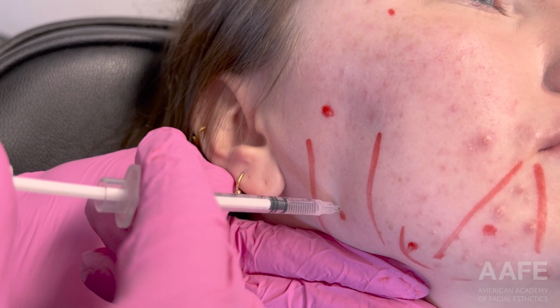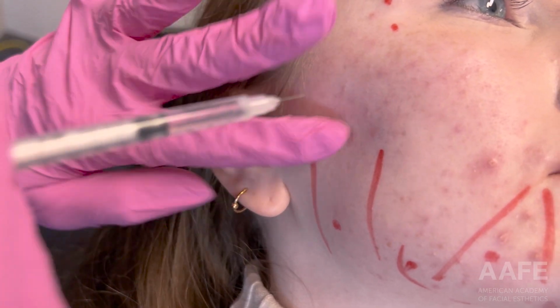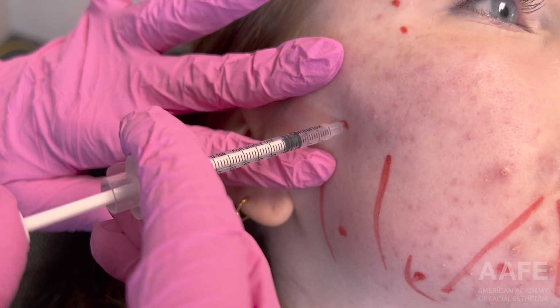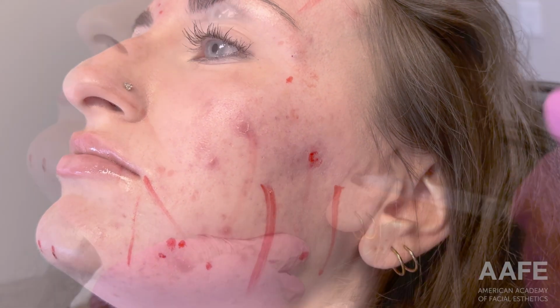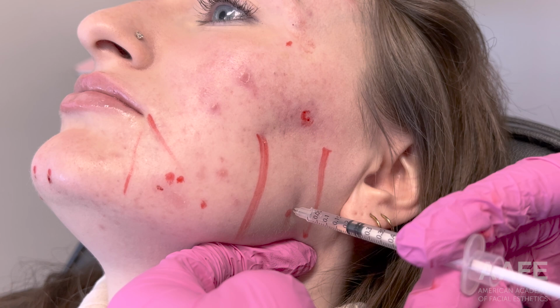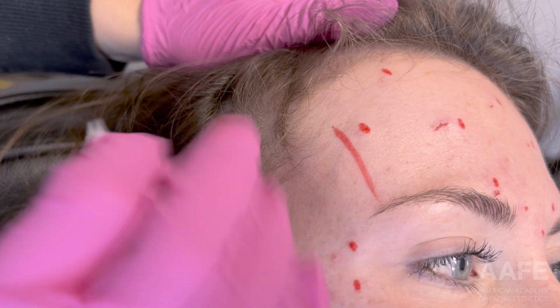Masseter, you can see here I'm going straight in 90 degrees all the way to the hub. I did go in 2 different sites right there, and then I'm also injecting the deep masseter, which is a little bit higher. Hers felt very, very tough, and it's just from overuse. These muscles get very strong and overworked in our patients with bruxism who clench, grind, things like that. And you can see here I'm going in a second site as well, but very close to each other so that we don't hit a muscle that we did not intend to.